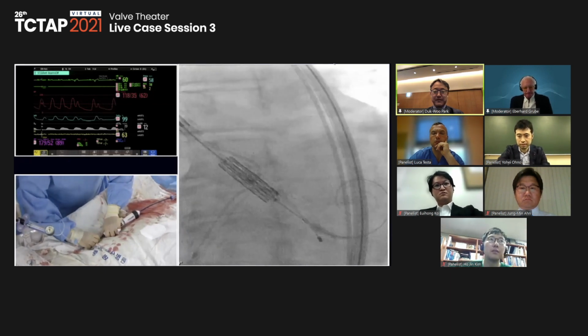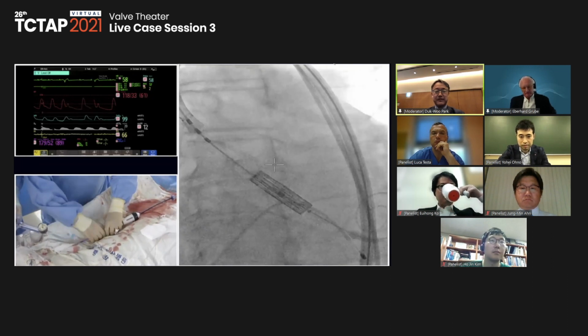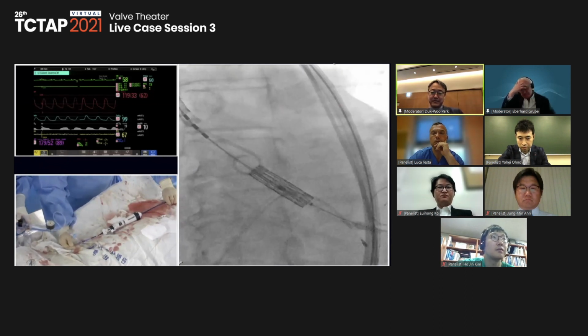Okay, past over here. We usually try to go half and half over here. Okay, this is the most important test.